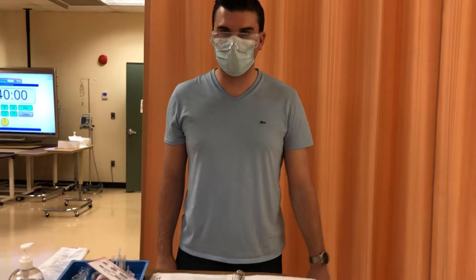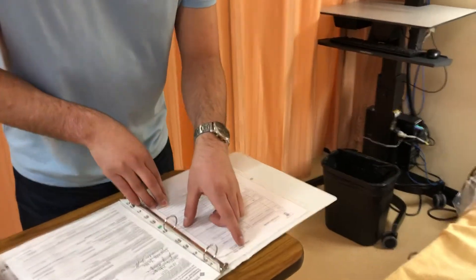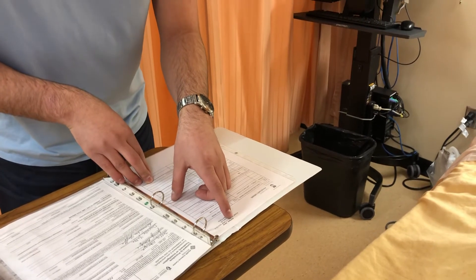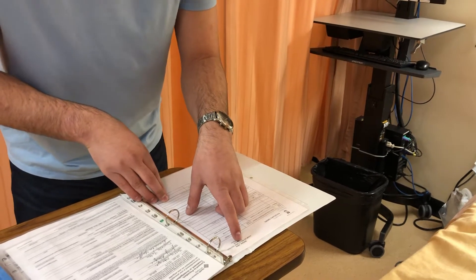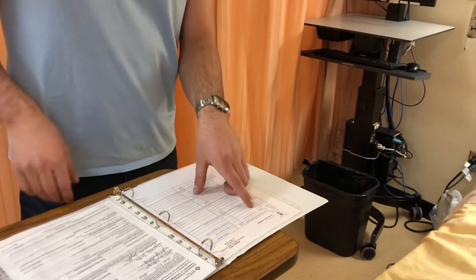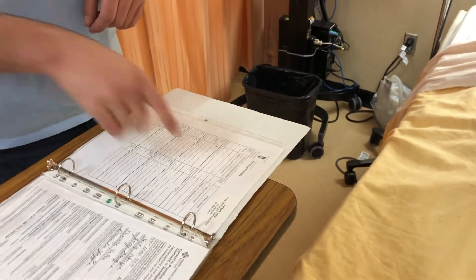Hi, my name is Zach and today I'm going to be showing you how to complete a blood transfusion. So today we have my physician's order here. The patient is Jerry Atrique — J-E-R-R-Y A-T-R-I-Q-U-E — FIN number 261-824-375, a 52-year-old male, under Dr. Ben Pierce. We're going to be giving one unit of packed red blood cells over two to three hours, and it's due now.